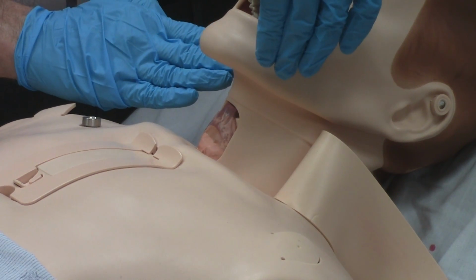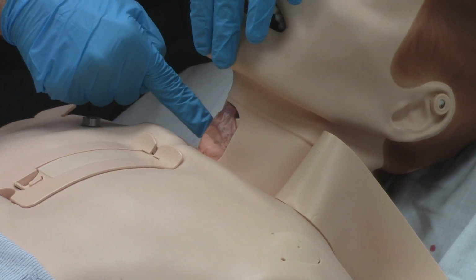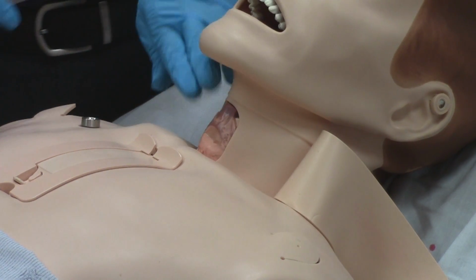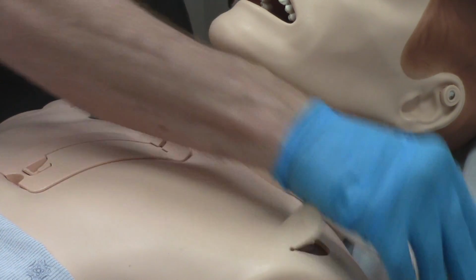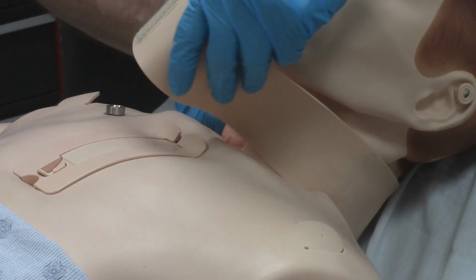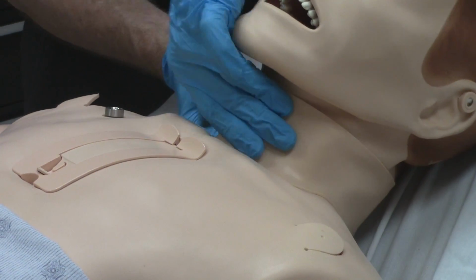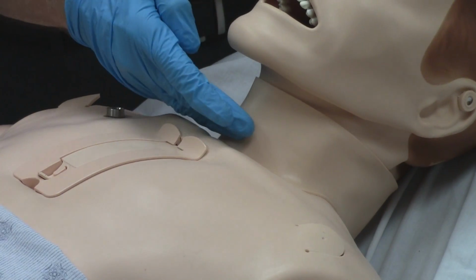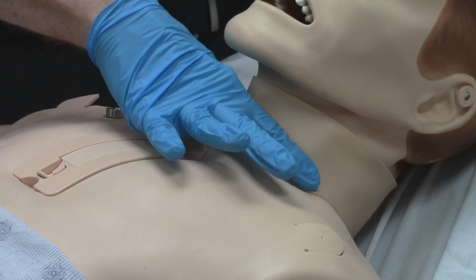Once you've performed a surgical airway on the mannequin, you simply replace the piece of pink tape from the roll that you'll find in the room on the difficult airway cart, and you rotate the skin collar just slightly to move the cut out of the way, and now it's possible to obtain additional surgical airways on the same collar.